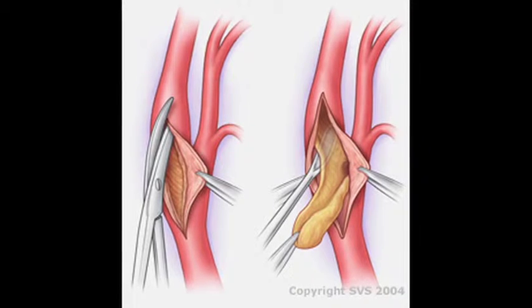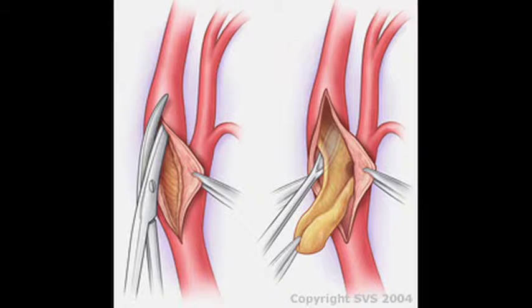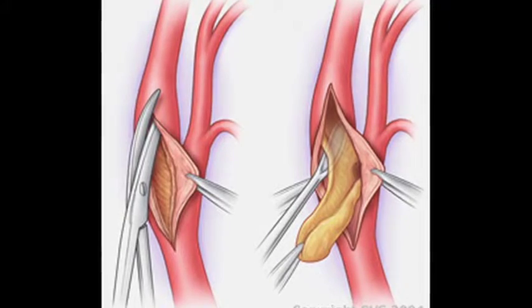So tell us a little bit about the high standard that's been set by traditional carotid endarterectomy, and tell us what exactly is carotid stenting. Carotid endarterectomy is a traditional operation whereby we remove the plaque in the carotid artery and remove the risk of embolization or debris going into the brain that would normally cause stroke. The operation has been around for many years and has been perfected to the point where the risk of stroke is about 1% and the risk of other complications is less than 5%. It's hard to top that.